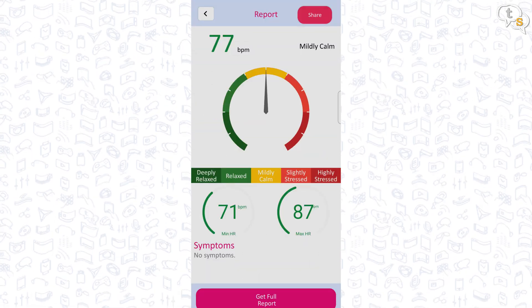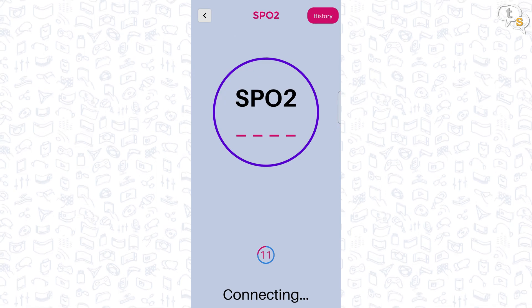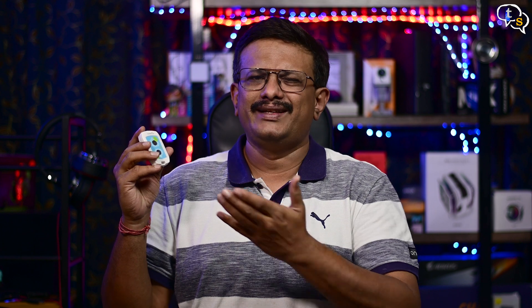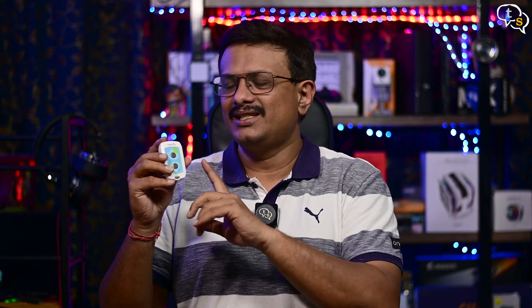We now have the option to take an ECG or a fitness test, but for SpO2, BP and temperature, we need a higher end model called the Sanket Life Multivital. I'm reviewing a number of medical equipment just to make sure everything is okay with the comfort of your home. And if you are someone who needs to take an emergency ECG, this device can at least help.